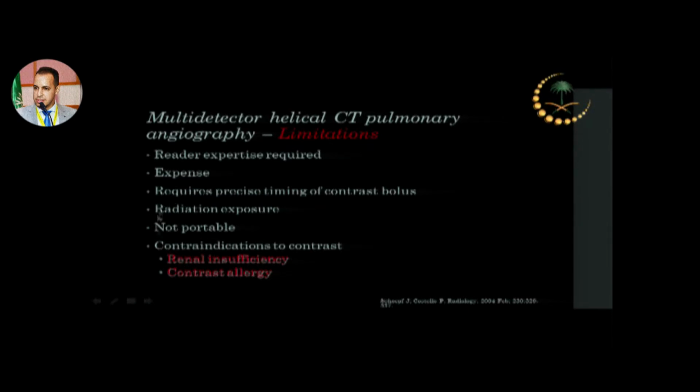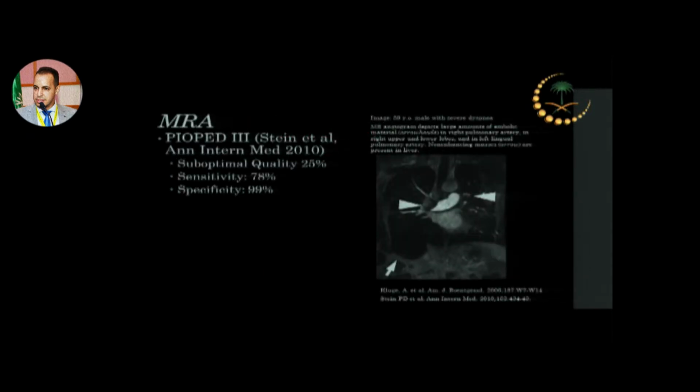It's not portable, so you cannot do it bedside. And it requires precise imaging techniques, so we need adequate training of the technologists and also adequate training of the physicians to interpret the examinations. MRA can be used in certain situations, but it has its own drawbacks. For example, in 25% of the time, the quality is suboptimal due to respiratory motion artifact, abnormal hemodynamics, pulsation artifacts, and so forth. But in general, it has very good sensitivity and specificity if it's done in the right technique.